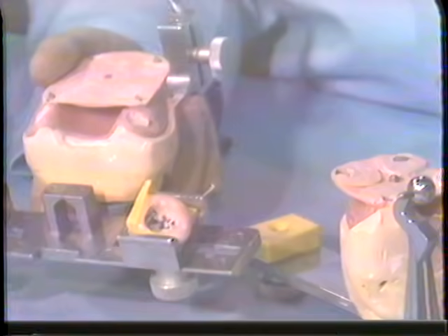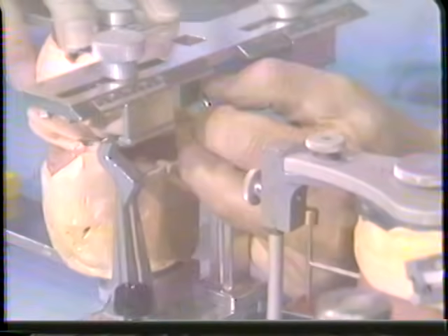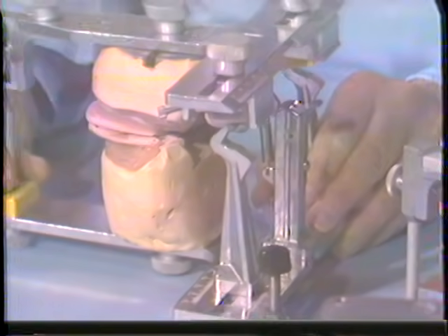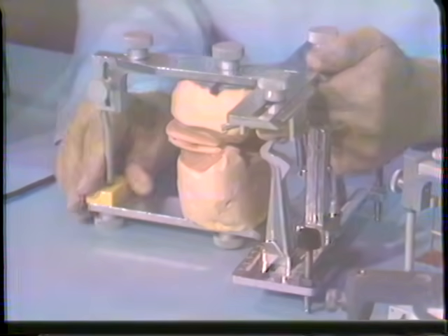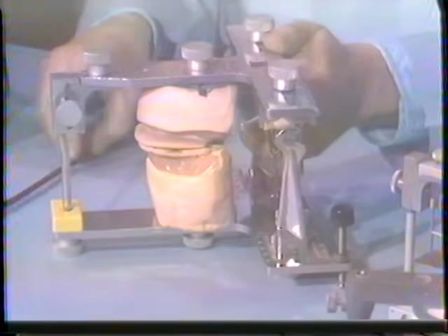However, again, it is somewhat time-consuming to use in terms of tracing out these particular elements, but it's certainly a closer reproduction of the posterior controls. We can now move and hope to simulate the patient's movements even more closely than with positional records that we made earlier.